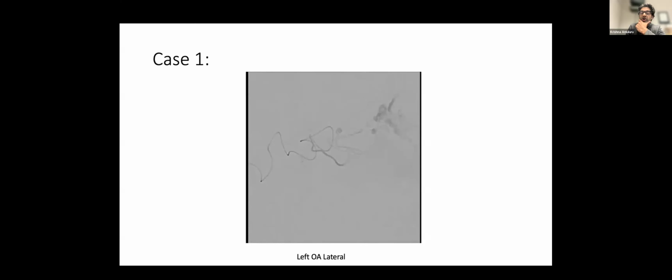From my perspective, whether or not the egress is occluded and whether we can see that angiographically is difficult to say. But from what I can see, the clip wasn't distal enough and there's still arterial supply. We agree on that. But there is still egress. One way you know there's egress is that you're able to inject glue. If there's no egress, how can the glue go? The glue is either going to go into an extravasated space in the head, or into some vascular space, and it's going into a vascular space.